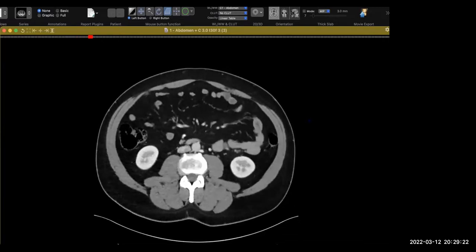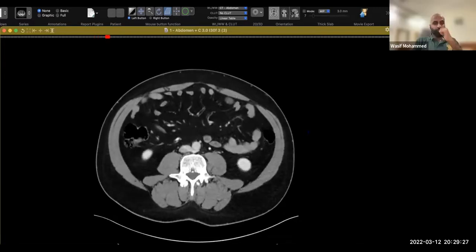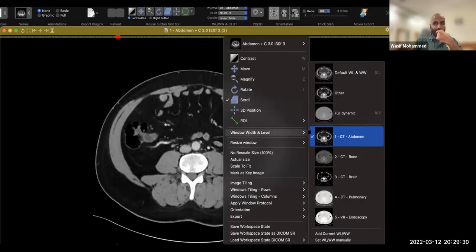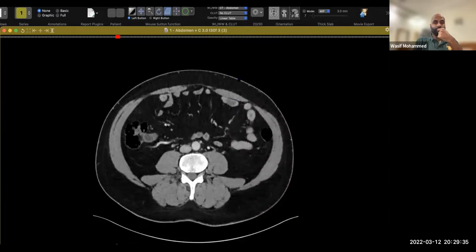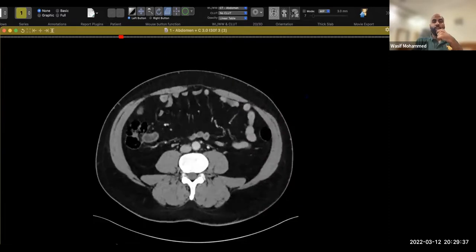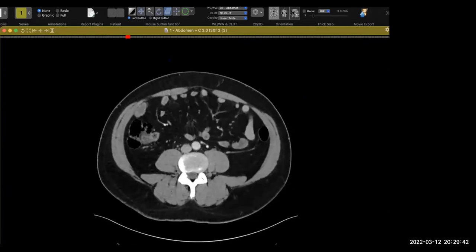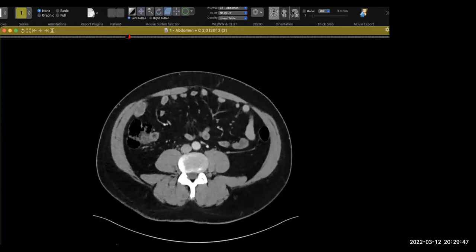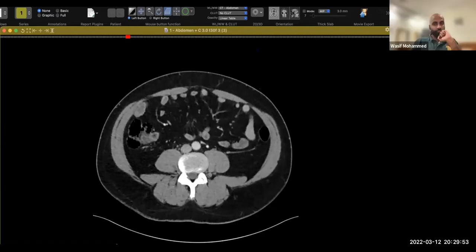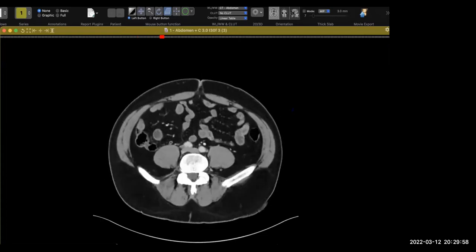I'm not sure if there is something wrong with my end. You want to scroll using the arrow keys? The right and left arrow keys on your keyboard. Okay, I think I'll use that. Just give me a second. Yeah, it's working a little better.